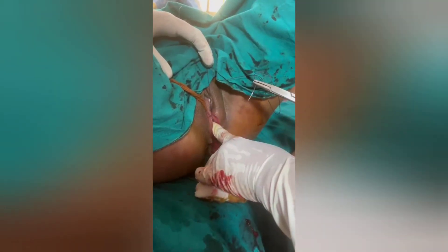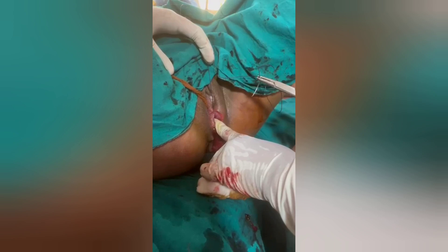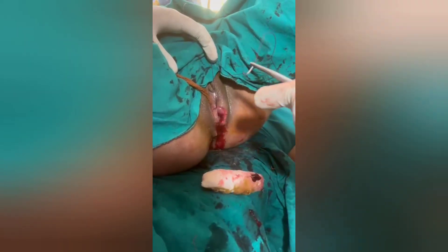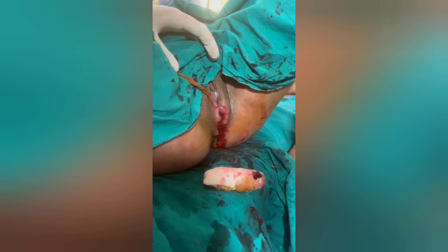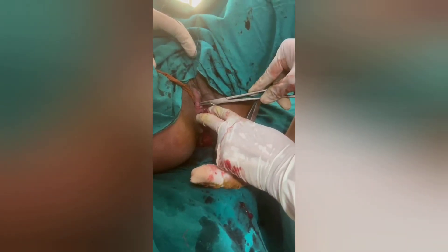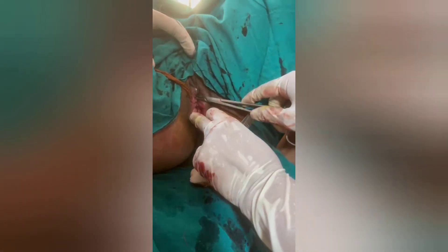Obliterating the dead space is equally important. I am just assessing the depth to determine where I should take the suture. I have assessed the depth and now I am going with the second layer of suturing — that is the deep transverse perineal muscles.